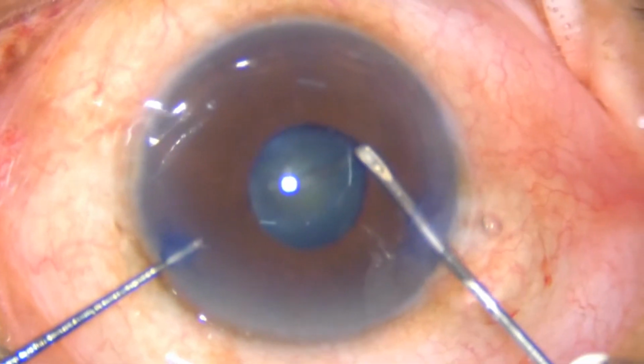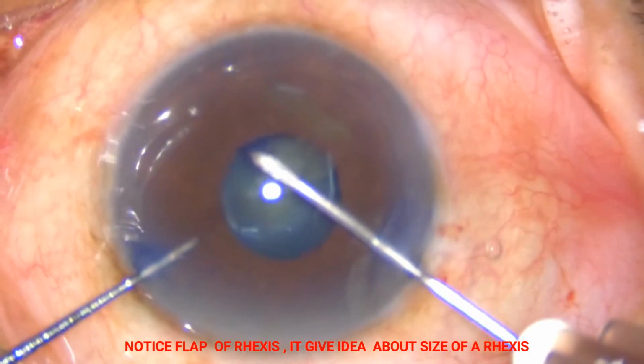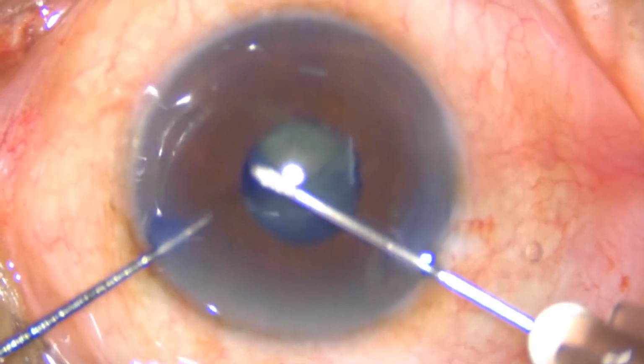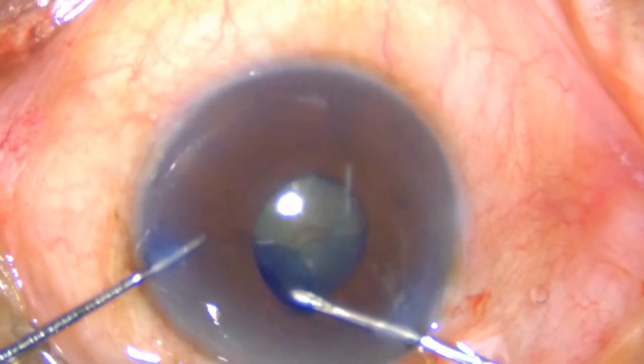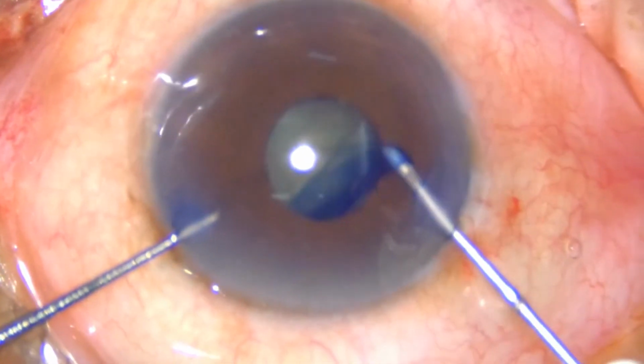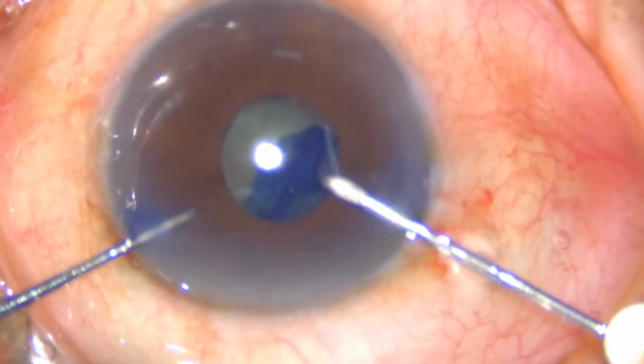Rhexis is very important while operating a small pupil case. You should always aim for a bigger rhexis, and looking at a flap of your rhexis margin, you can realize how many millimeters your rhexis is. Here I am going to demonstrate my rhexis size.